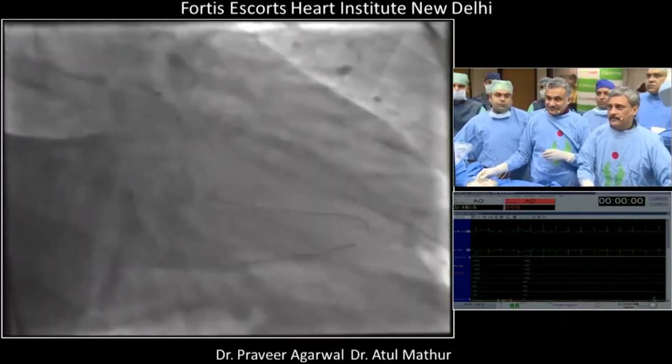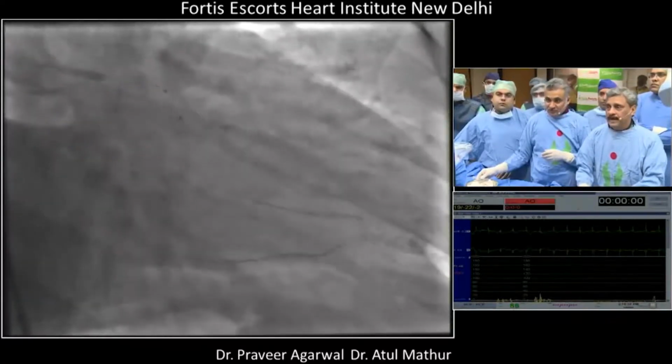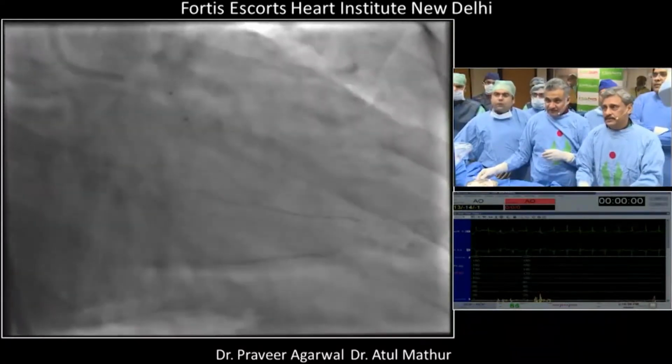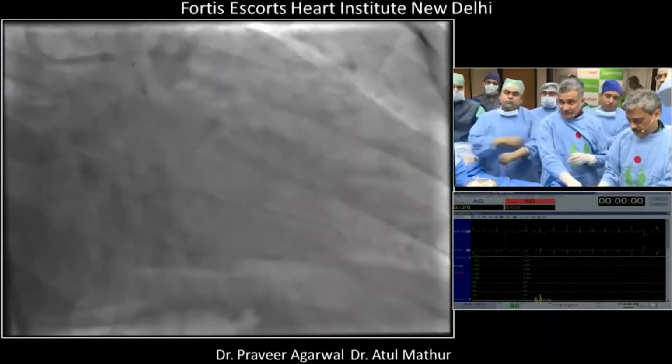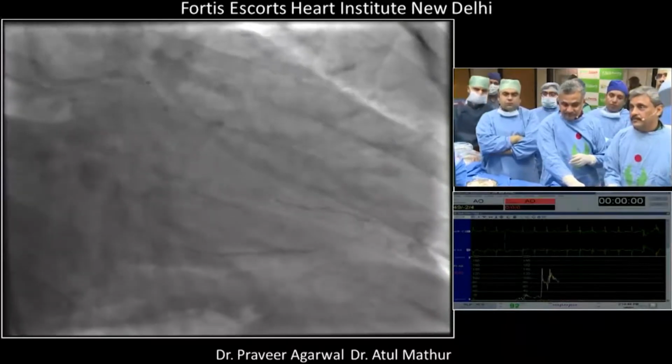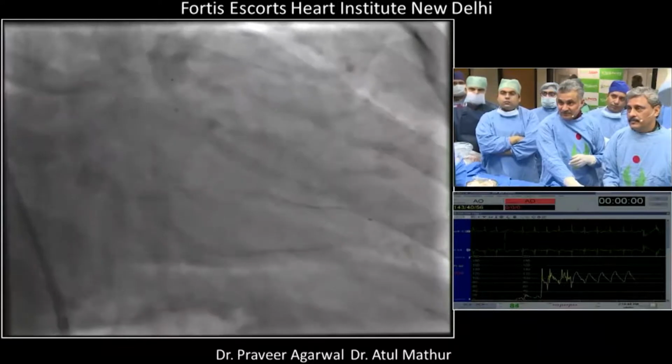So this is a 3.0 or... it's bulky, you know? 2.5? 2.5. No, it's a 2.5 in the side branch. So you're giving a little tough time. You see, fibrosis? Yeah. After the dilatation with the balloon also it's not going. Probably calcified. So this is the fibrosis in all these lesions.